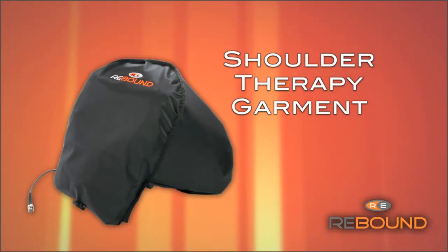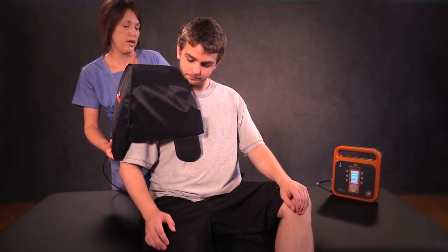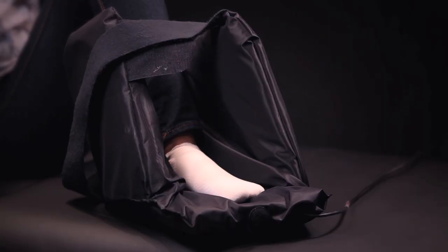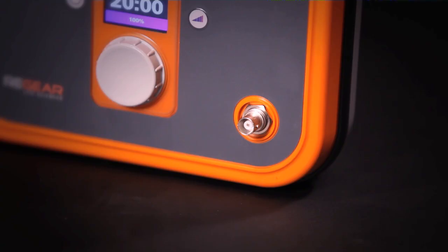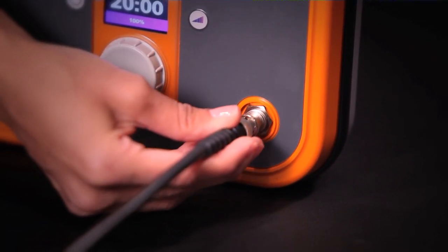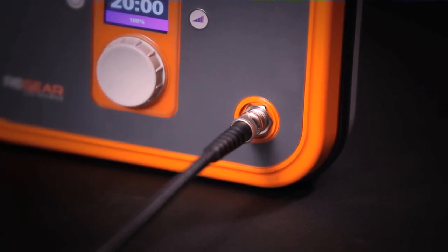The shoulder therapy garment is a one-size-fits-all garment used for both the right and left shoulder. To use, place the garment on the patient's shoulder then attach the velcro underneath the opposite shoulder — this does not need to be tight, just secure. Additional uses for the shoulder garment include using it like a boot to treat issues with the foot such as plantar fasciitis, or to treat limbs that cannot be straightened enough to fit into a cylindrical therapy garment. Once the appropriate garment is selected, attach it to the Regenerator by firmly pushing the connector into the cable connector and turning clockwise until it locks into place.